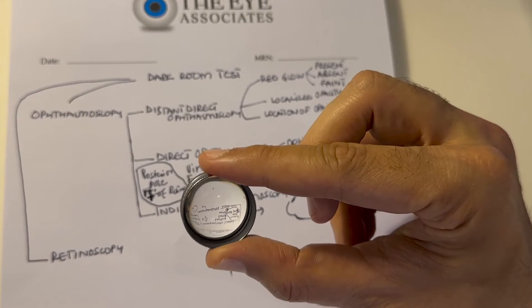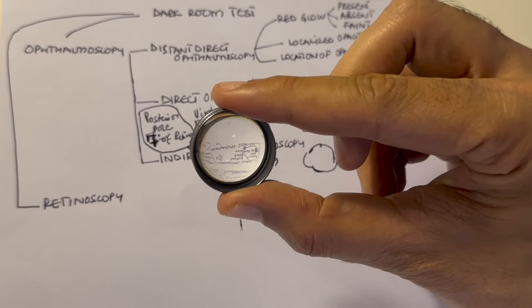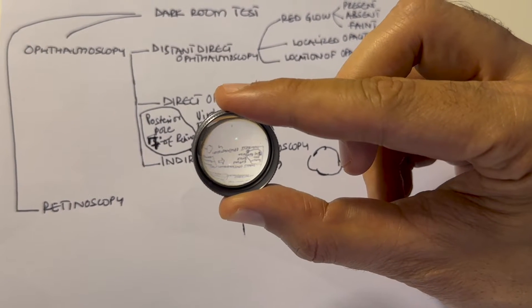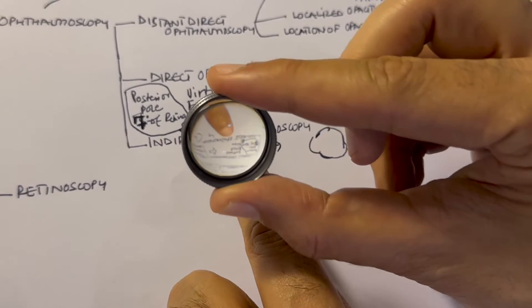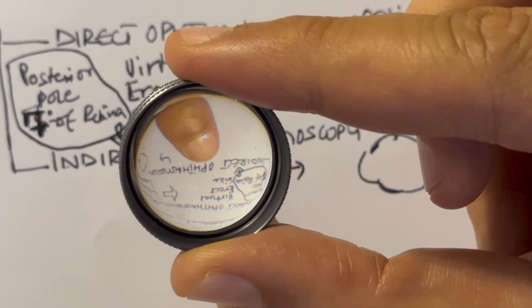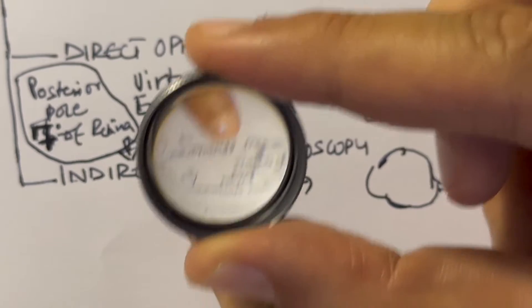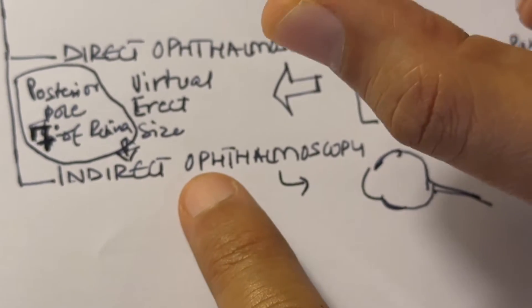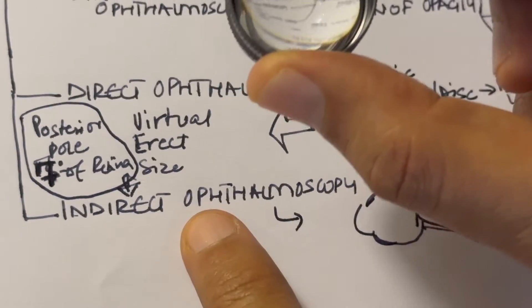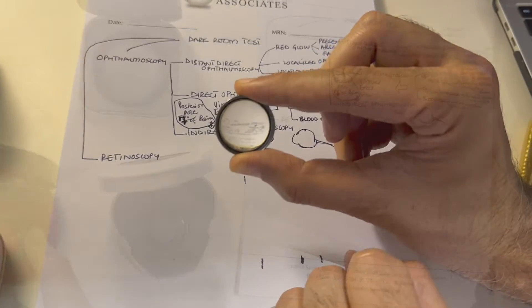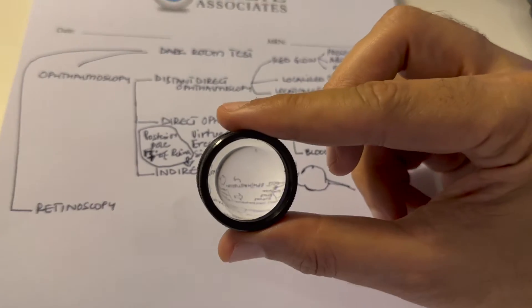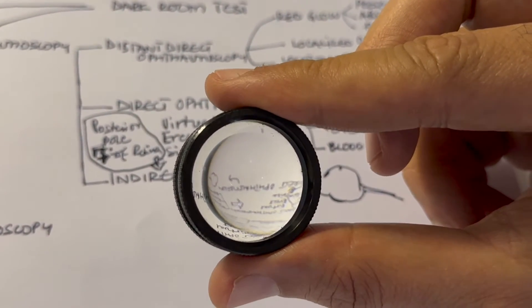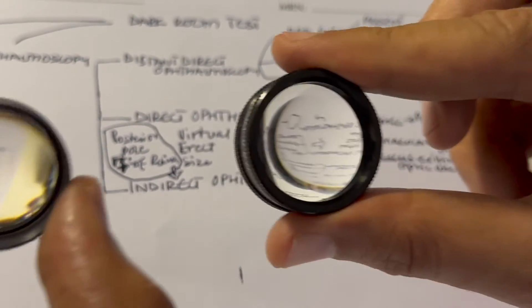In order to do indirect ophthalmoscopy, you can use condensing lenses. This is a super field or a 90-diopter lens, and this is used when you are examining the fundus through a slit lamp. As you can see, the image is inverted in this lens and slightly minified.